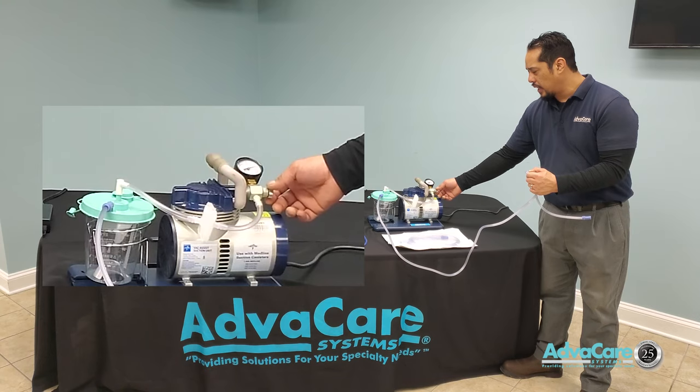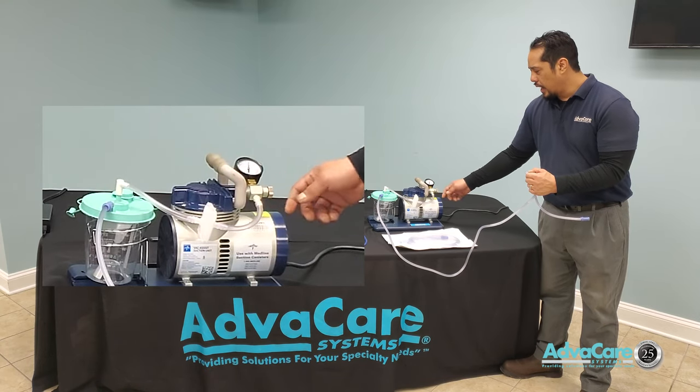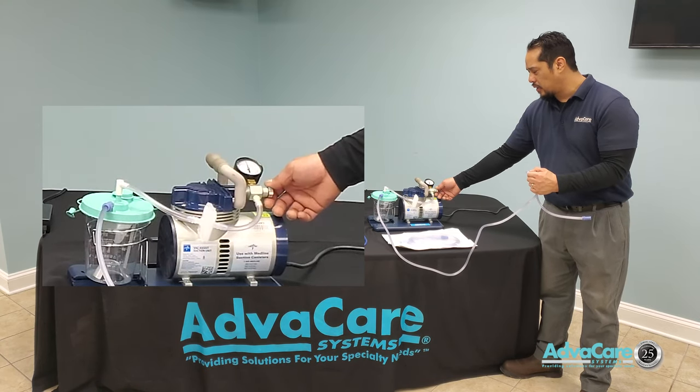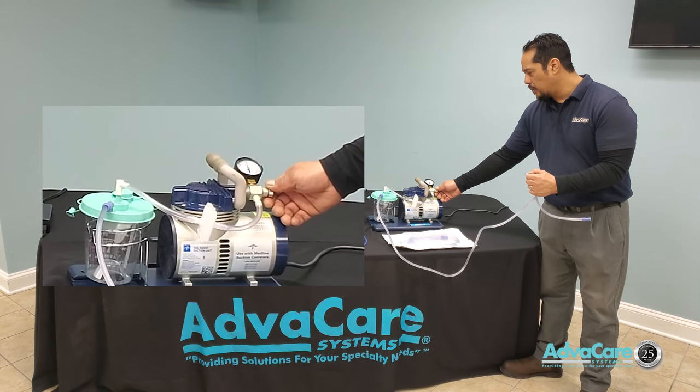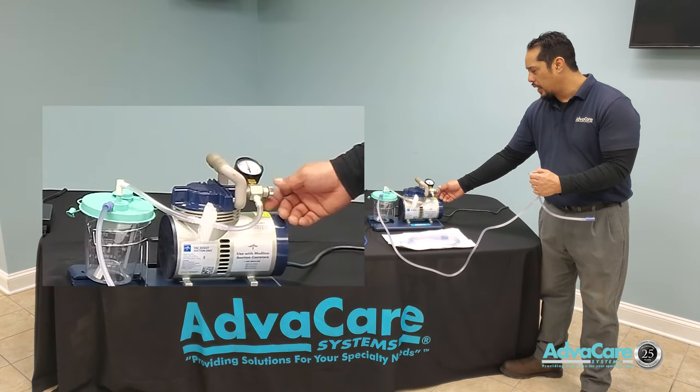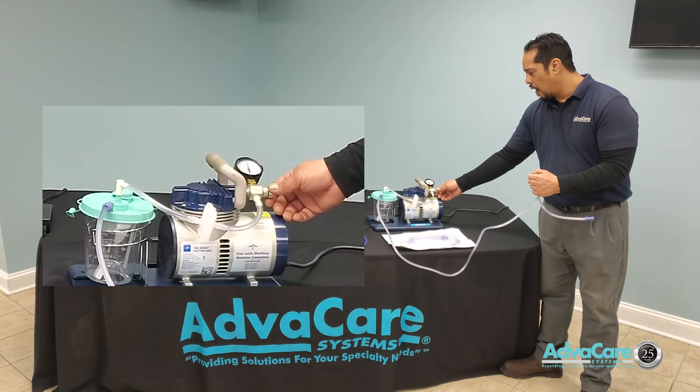You may then turn your pressure control dial — counterclockwise to decrease, clockwise to increase — in order to dial in the specific pressure needed to clear any type of blockage.